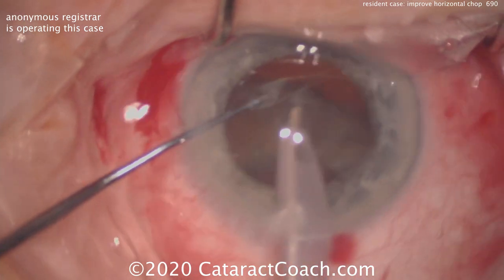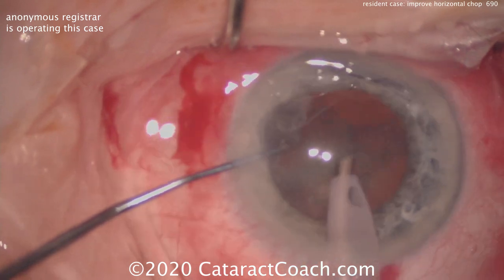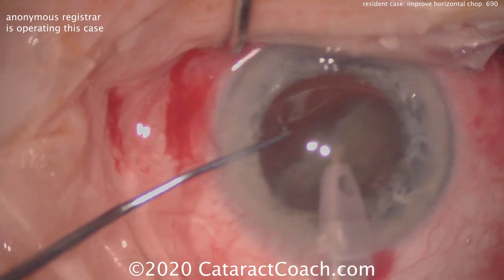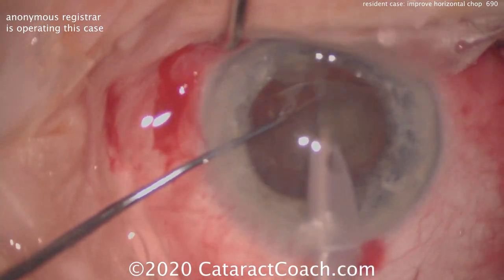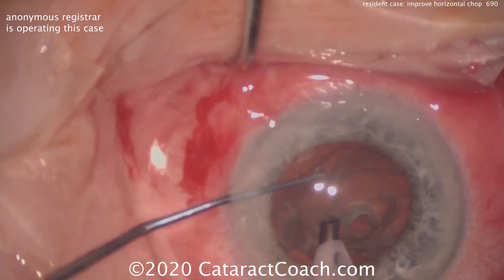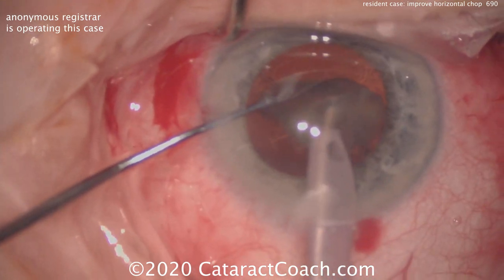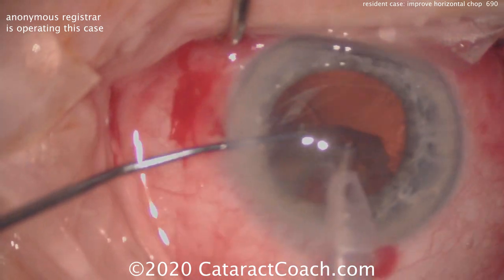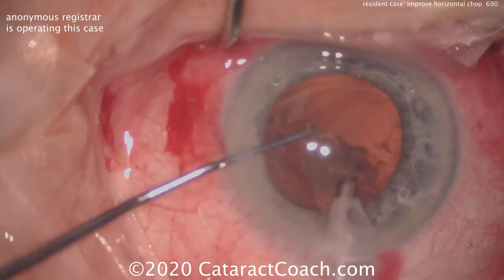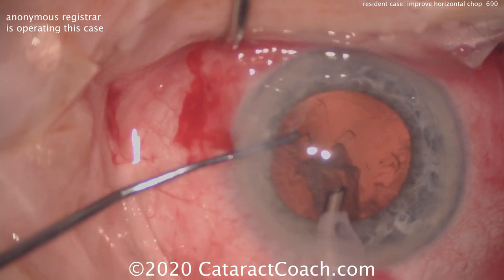When I go in with the phaco probe for this chop technique, I would go in beveled down in order to get immediate and complete occlusion. Remember, this is a peristaltic phaco pump, and to get high vacuum — meaning good strong holding power — we need to have occlusion of the phaco tip so that energy or vacuum level can build up. Here in this small piece you have a nice build-up of vacuum, good holding power, the piece can be brought up towards the phaco tip. But the problem — if you watch the video again — at the very beginning the first chop was done with the phaco tip not occluded.